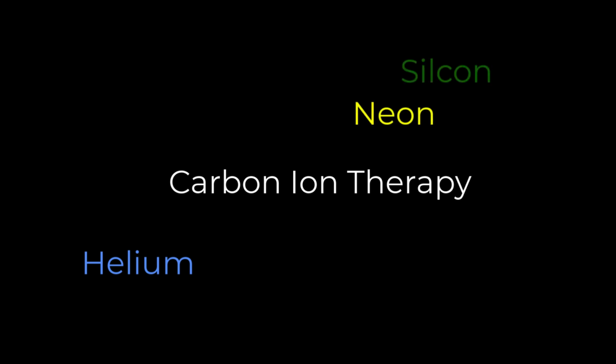So we're going to talk about carbon, but you could also have helium. And then you have some that are heavier than carbon. You have neon, silicon, argon. And those are even more rarely used, but we're focusing on carbon because that's the most common one right now.